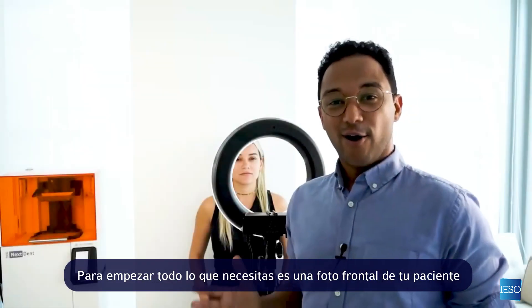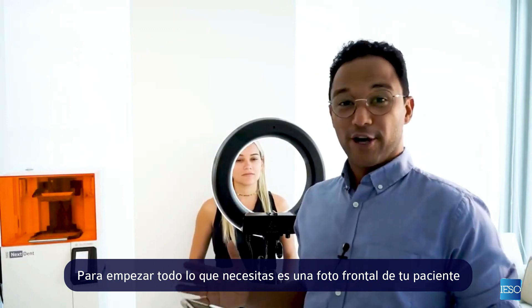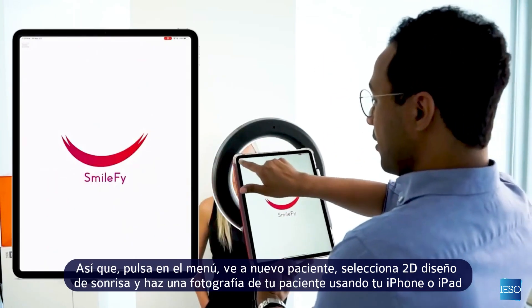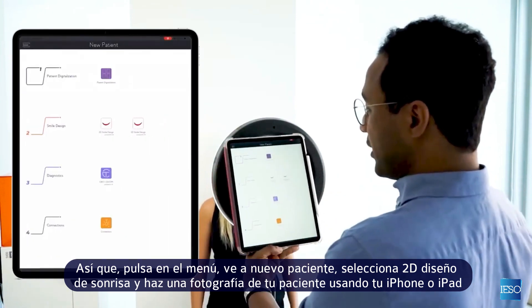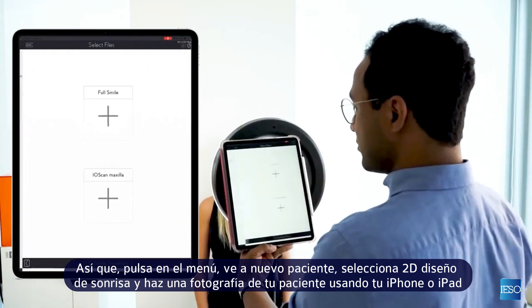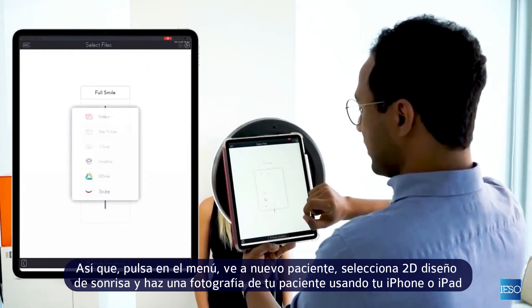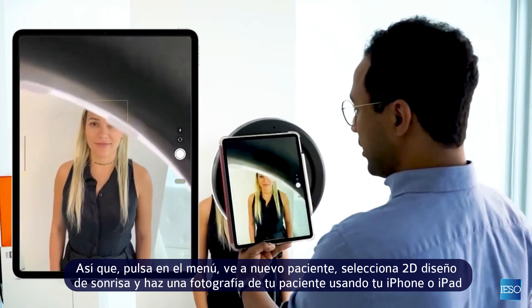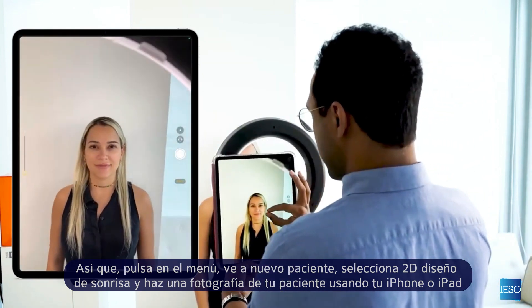To get started, all you need is a frontal facial picture of your patient. Tap on the menu, go to New Patient, select 2D Smile Design, and take a picture of the patient using your iPhone or iPad.